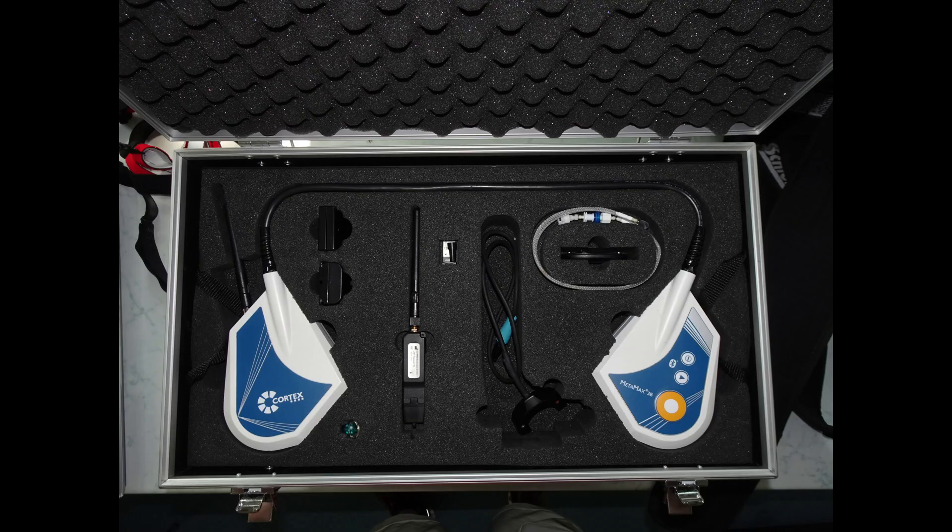This photo shows the following: the mobile Spiro device, the two USB sticks with software key and radio antenna, the volume sensor, the gas sensor, and the heart rate sensor.